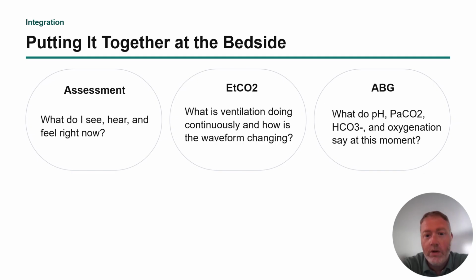Keep it simple. End-tidal monitoring, if you have that available: what the initial value is, how it trends over time, how the waveform looks, whether there are any waveform disturbances that suggest that you need to intervene in a different way. And then, of course, ABGs, and especially when we get into intubation and mechanical ventilation, making changes based on blood gases. Those are paramount for folks who are in respiratory distress.